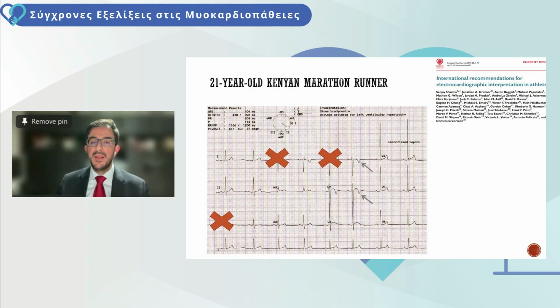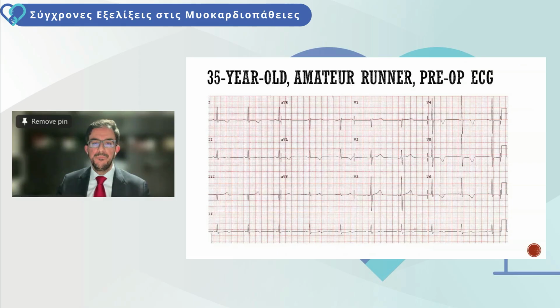So the ECG I'm depicting here will be considered as normal as we don't take into account V1. For the inferior it will be II and aVF. For the lateral territory, they make an exception given the importance, and even a single T-wave inversion in lead V5 is considered abnormal and requires further evaluation.